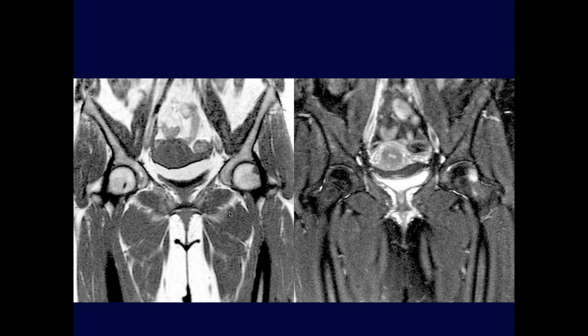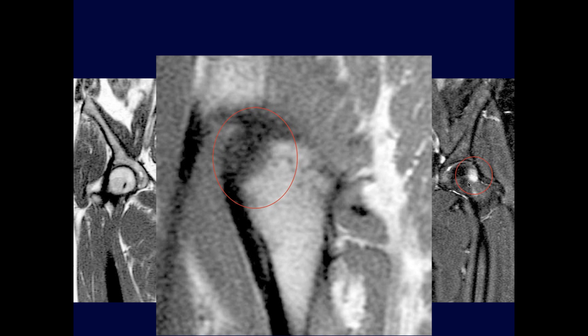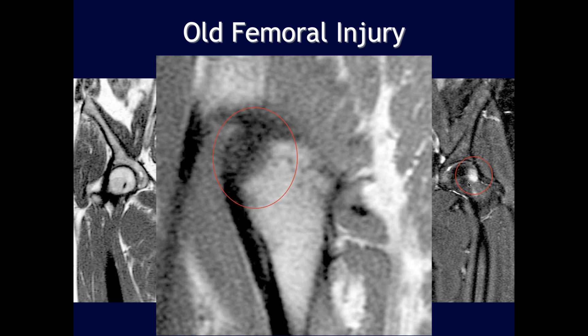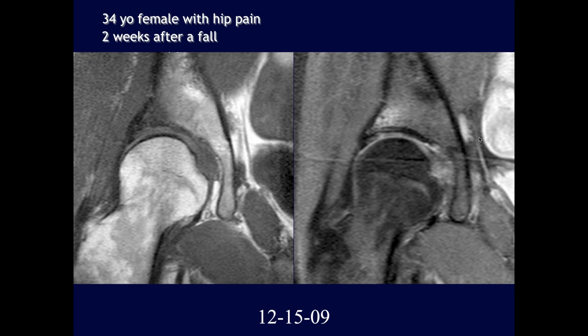Coronal images of bilateral hips show marrow edema along the left superior femoral head-neck junction. This may reflect an osseous contusion or remote injury, with possible cortical irregularity noted.